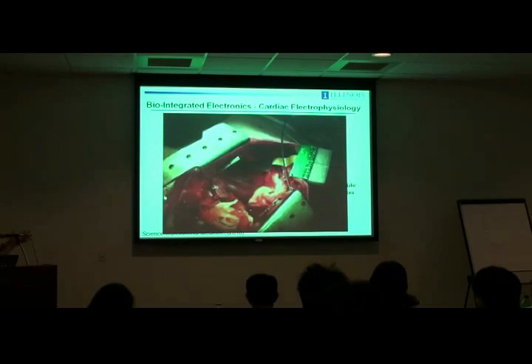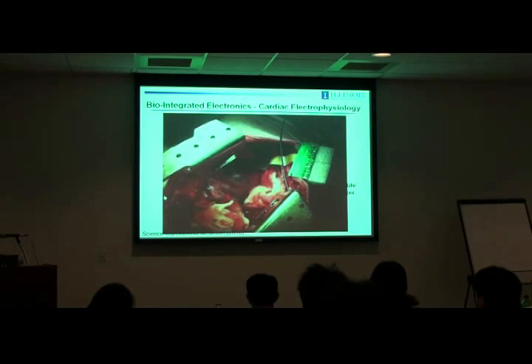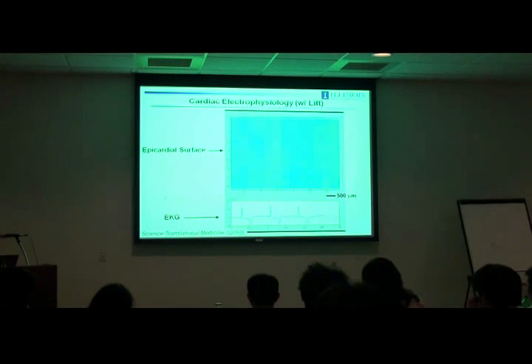So what I'm going to show you is this device operating in a purely diagnostic monitoring mode, where we can make these things multifunctional. So in this case, it's actually also pacing the heart in a sophisticated way. So you see the heart beat rate change dramatically. Somebody hit a computer key over here, and that changed the kind of pacing that was going on. We also have devices that can actually do the ablation. But what's published is only the diagnostic part of that process.